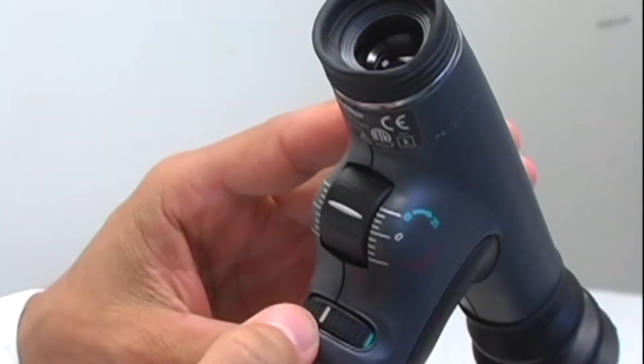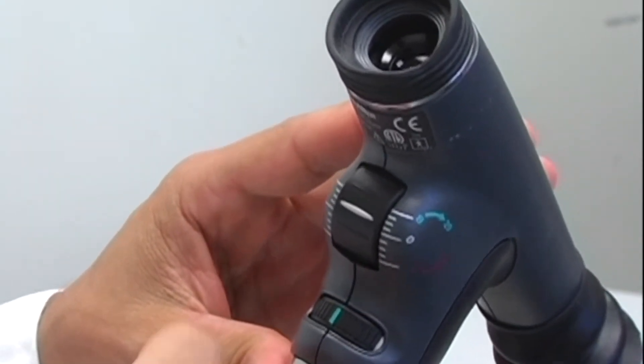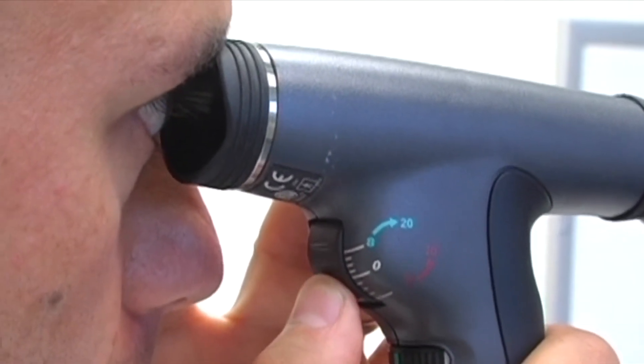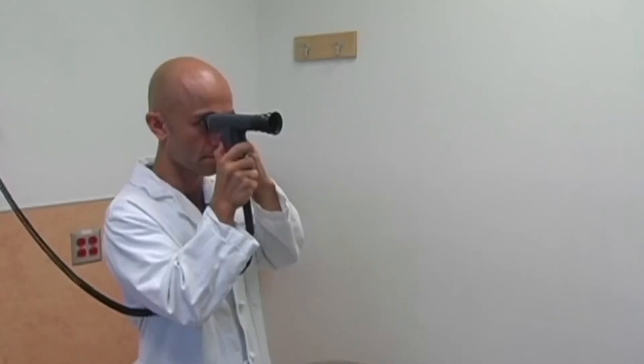Set the aperture dial to small, which corresponds to the green line. Look through the scope with your thumb on the focusing wheel. Turn the focusing wheel until you see objects clearly at 15 feet. This will make any adjustments for your own eyes' corrective needs.